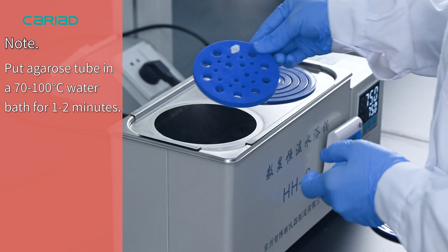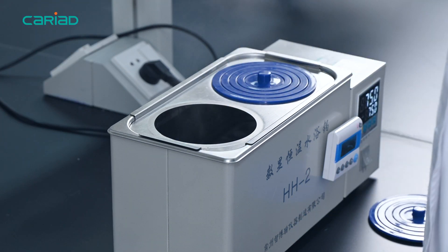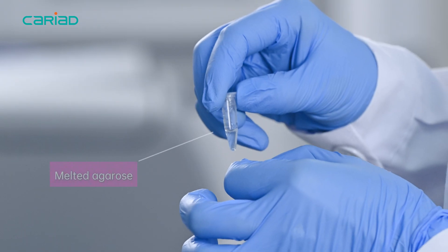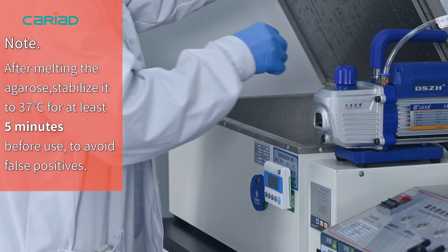Note: place the agarose tube in a 70 to 100 degree water bath for 1 to 2 minutes. Note: after melting the agarose, stabilize it to 37 degrees for at least 5 minutes before use to avoid false positives.